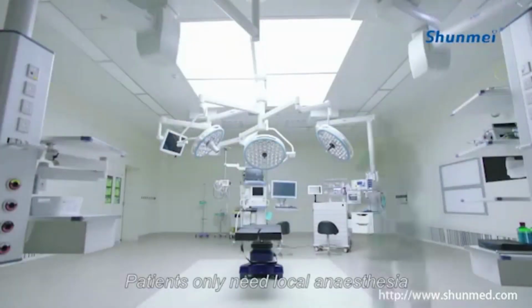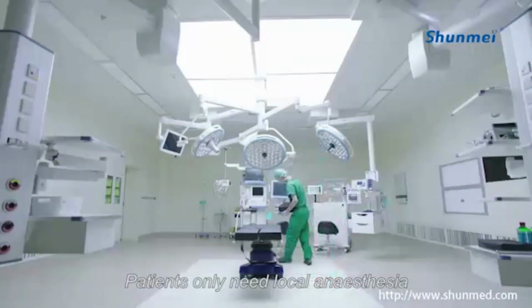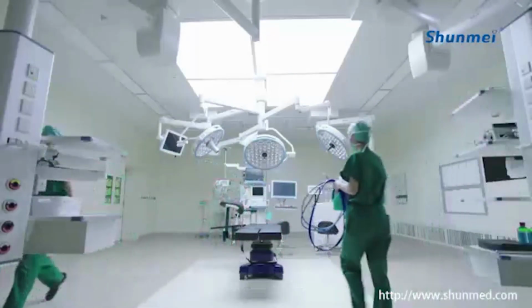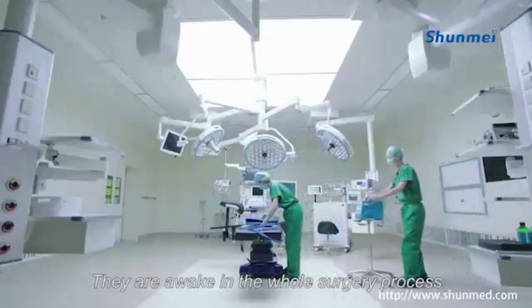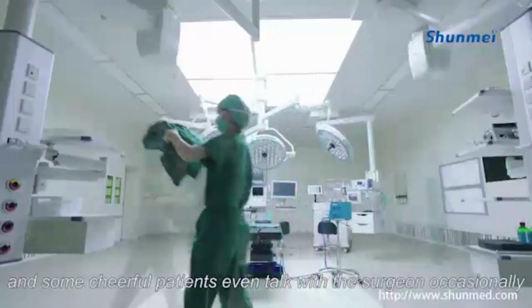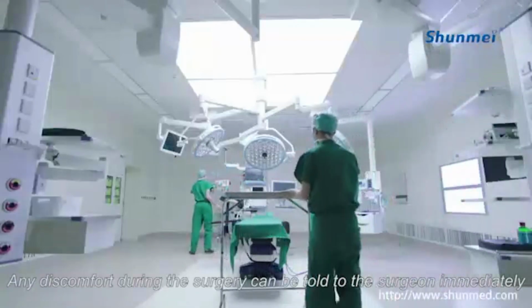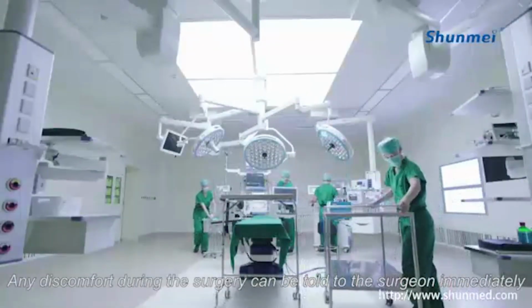Patients only need local anesthesia in the wrist or leg, with a relatively small cut. They are awake during the whole surgery, and some cheerful patients even talk with the surgeon occasionally. Any discomfort during the surgery can be told to the surgeon immediately.